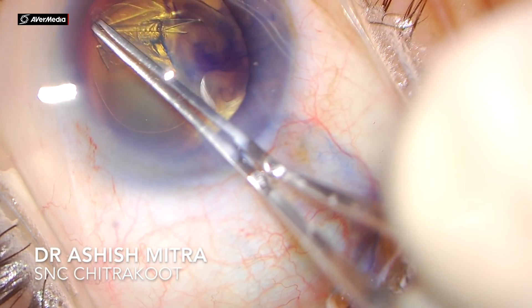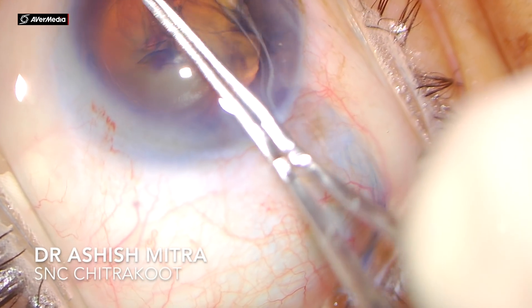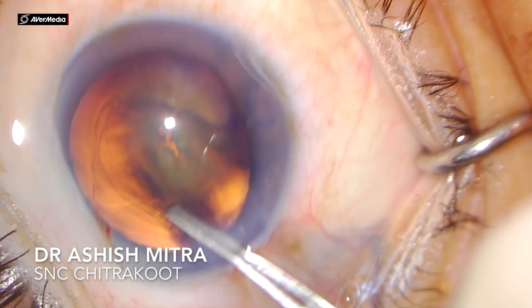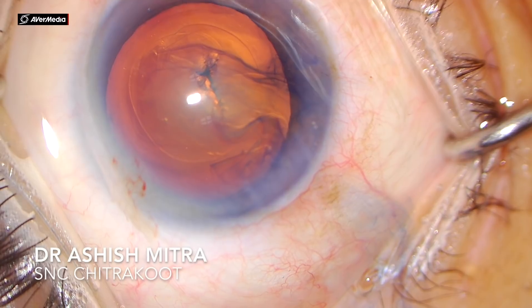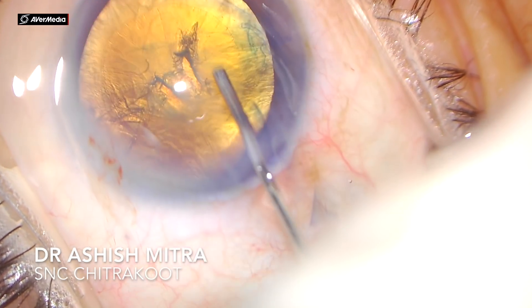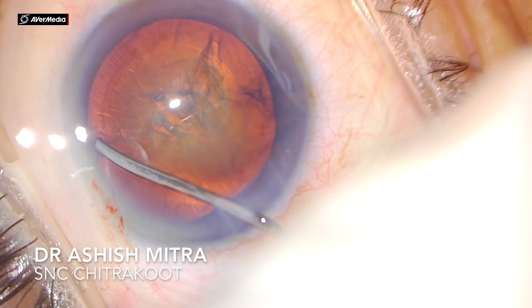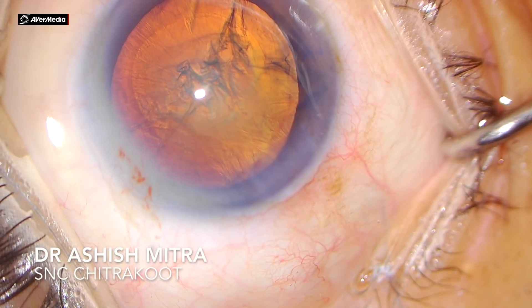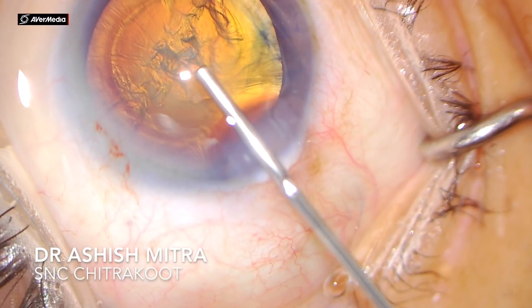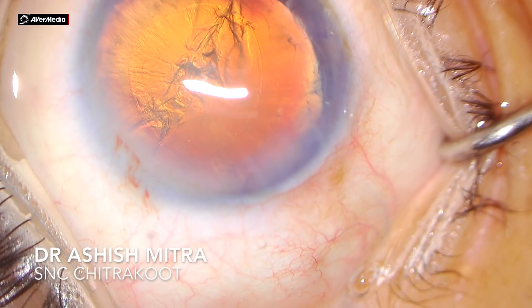As you can see, I am making the capsulorhexis. I feel it is always easier to use utrata forceps rather than cystotome because it is more controlled, and just in case you land up with any peripheral extension, it is easy with utrata forceps to pull it back inside.